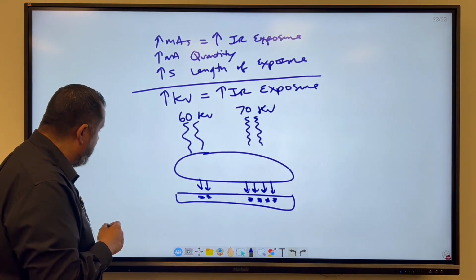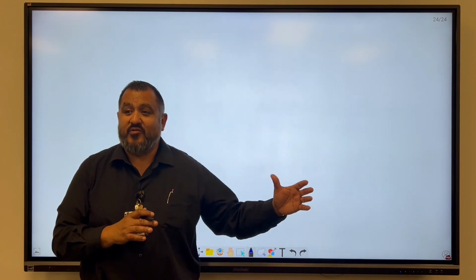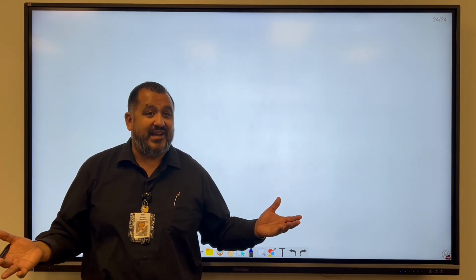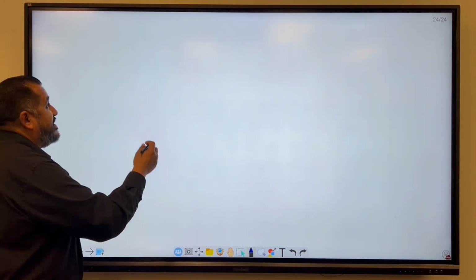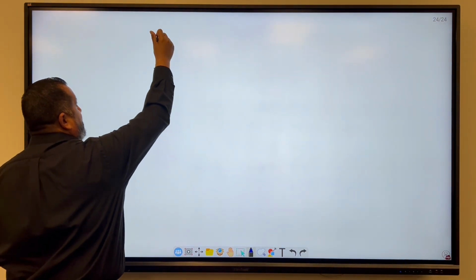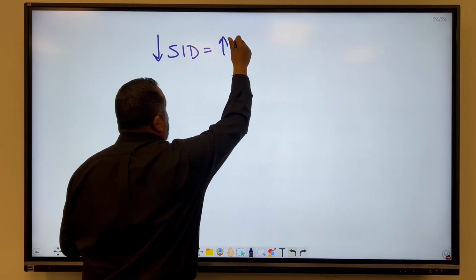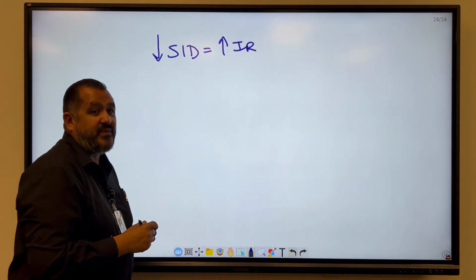What's the other prime exposure factor that we said, but not on your console? It's in the exam room. It's going to be your SID, correct? So the SID has an inverse relationship with exposure. So as you decrease SID, you're going to increase IR exposure.